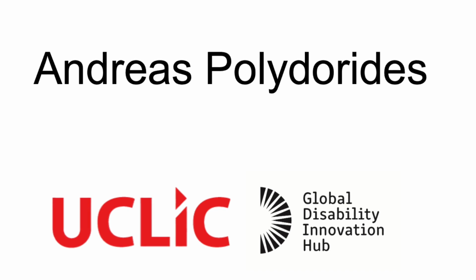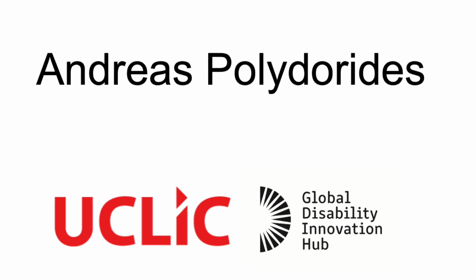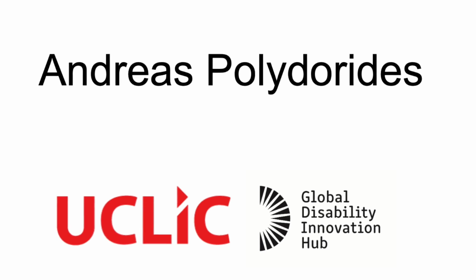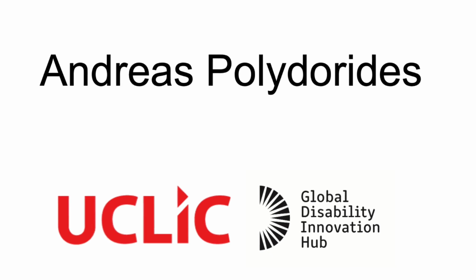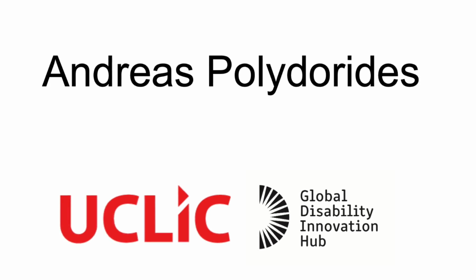The first method, which we quite unimaginatively call G-code generation, is fully comprised of Python code, currently using the open source FullControl library. This allows us to generate custom G-code, the commands 3D printers understand, to create lattices in the size of the desired cushion. By using a pressure map, we can customize its density at a localized level, so that the load is more evenly distributed. We created a simple web form, which you can access from your devices during the conference, so that you can generate your own cushion.